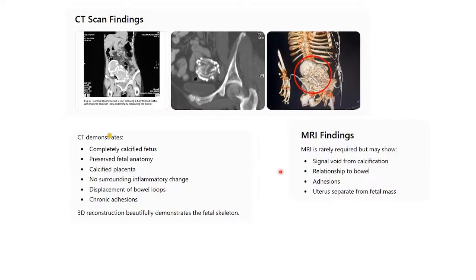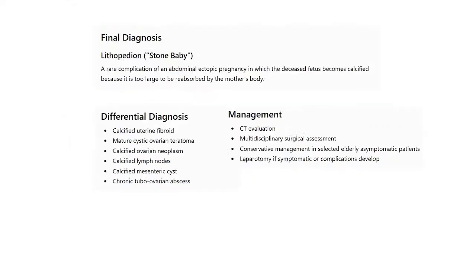So when you are practicing radiology, you must also appreciate the role of other imaging modalities, and you must know to what extent some modalities might not be necessary. In this case, we have made a diagnosis already, so it's not necessary to proceed to MRI, which is an unnecessary expense to the patient.